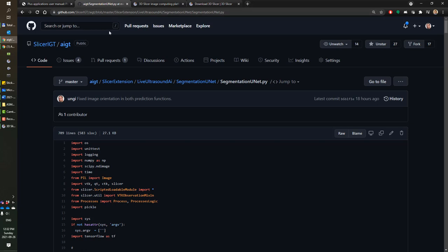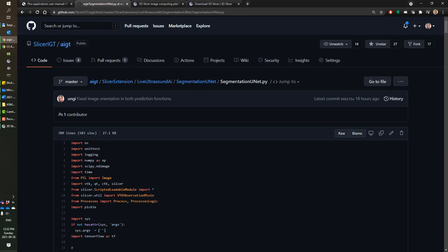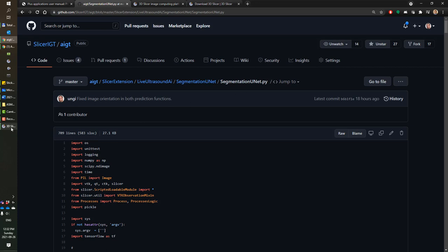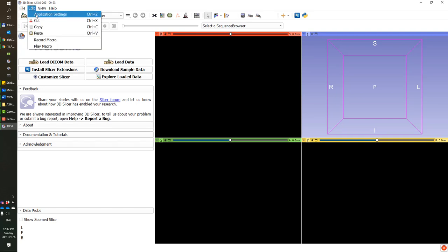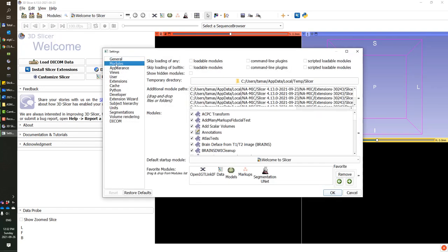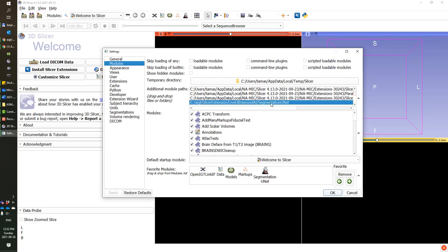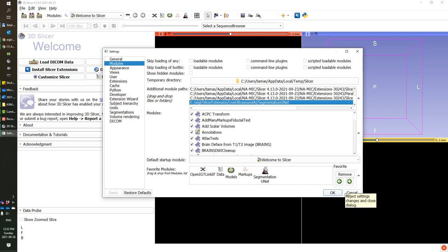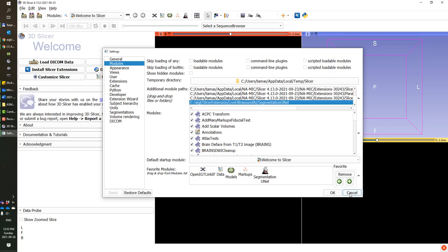Other than these extensions, we will need to add the SegmentationUNet module from source code. Clone the repository from GitHub slicer IGT slash AIGT, find the file SegmentationUNet dot py, and add it to Slicer by opening the application settings, go to modules tab, and drag and drop that Python file in the area for additional module paths. After that, you will need to restart your Slicer for the new modules to appear.